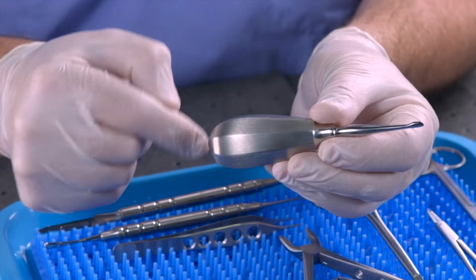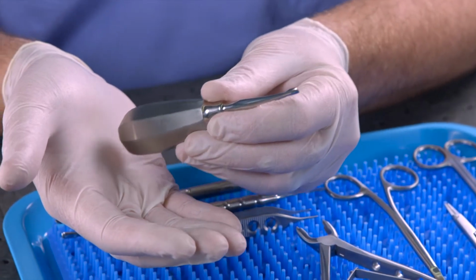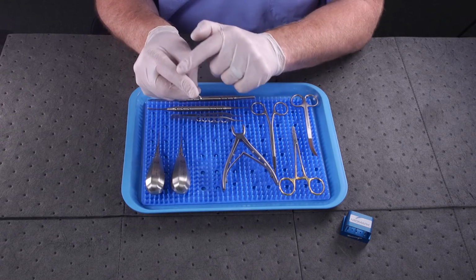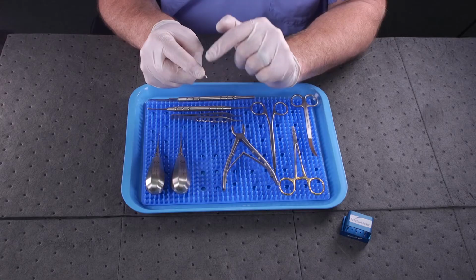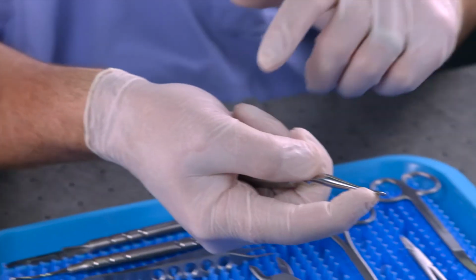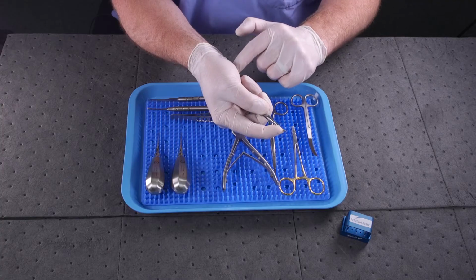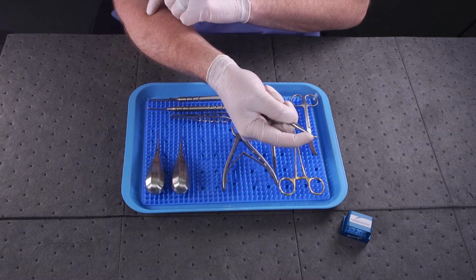The bulbed portion of the handle should fit into the palm of the hand and be grasped firmly with the fingers, using the forefinger to come up and act as control for the cutting blade. In this aspect, we have the instrument. The bulb is in the palm of the hand, and the palm is in line with the wrist, which is in line with the forearm.